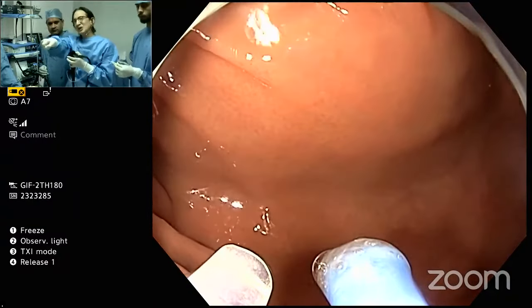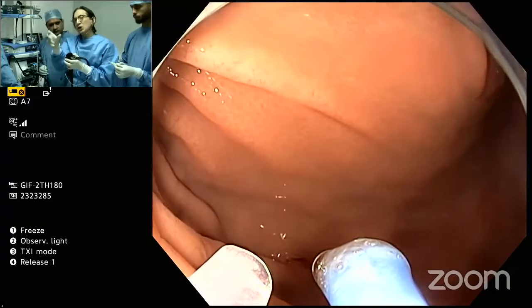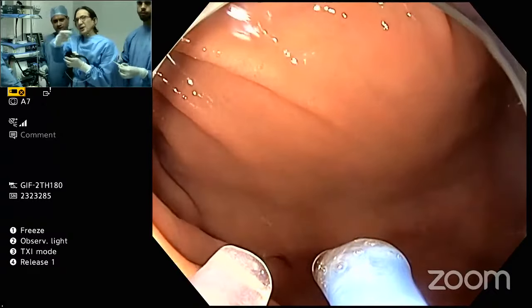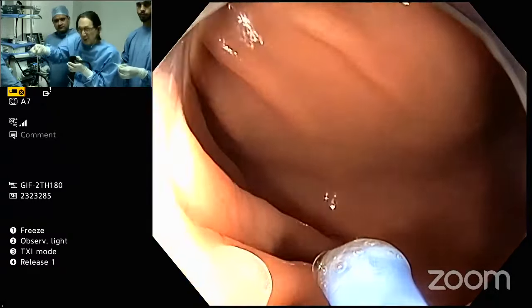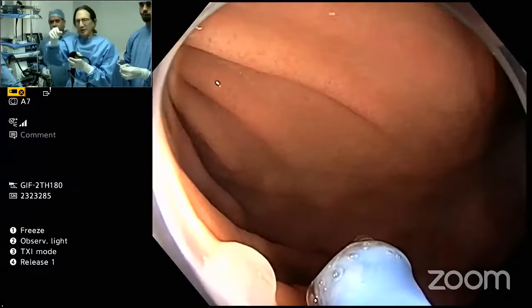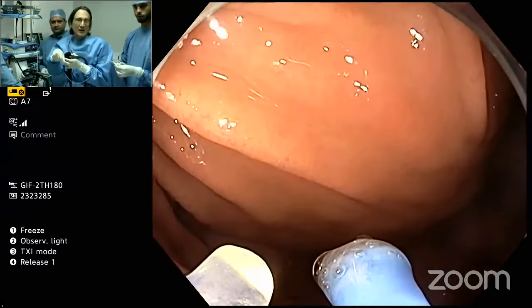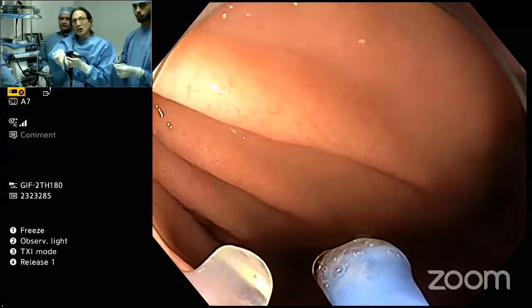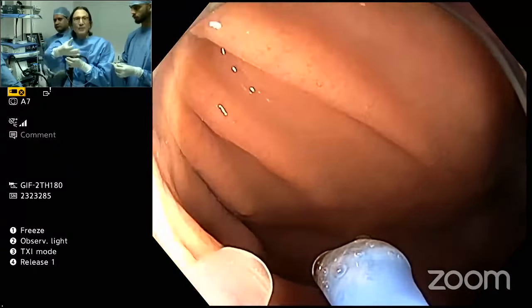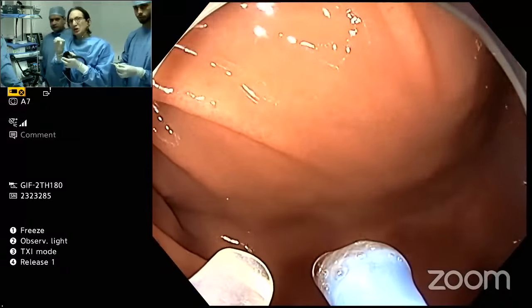You use the helix to pull the tissue. And then you get a pleat of tissue, and then you throw your needle across that tissue. So you have the anchor exchange catheter, and the needle driver goes through, then you catch the tip, and you throw the needle basically back and forth. That helix is kept inside the working channel, but you can't detach the suture from the handle. So this is just a modification that allows you to detach the suture from the handle.